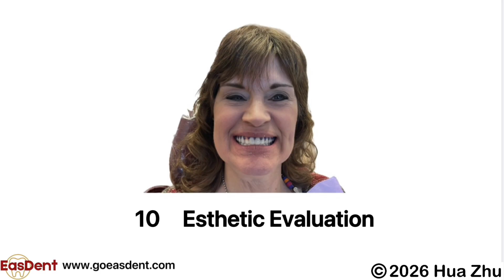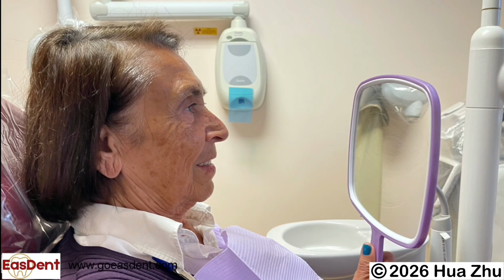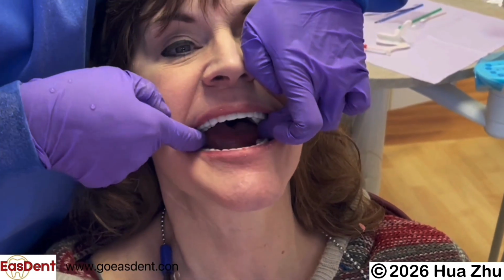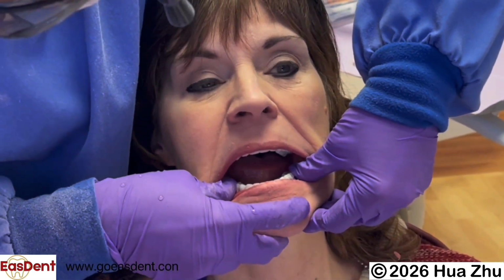Aesthetic evaluation. The Easdent final impressions with teeth in place closely resemble the shape of dentures. They can be used as try-in dentures to evaluate aesthetics. Give the patient a mirror, and get the patient involved in the aesthetic evaluation with you. Seat them in the mouth completely. Good impression should have a little suction and stay in the mouth.